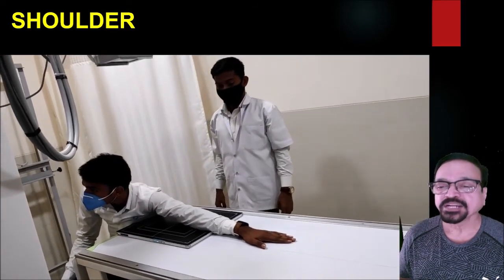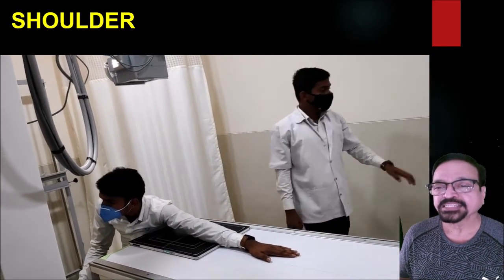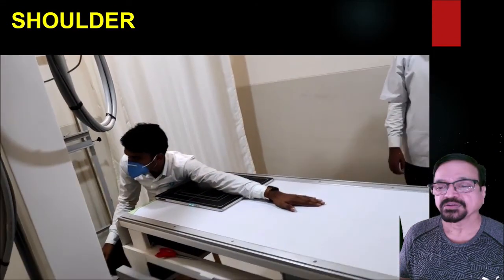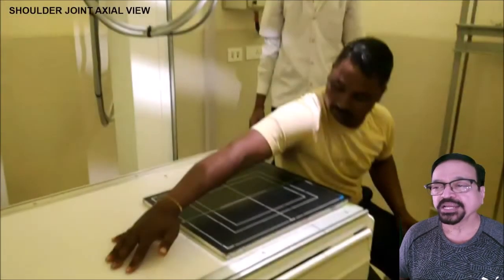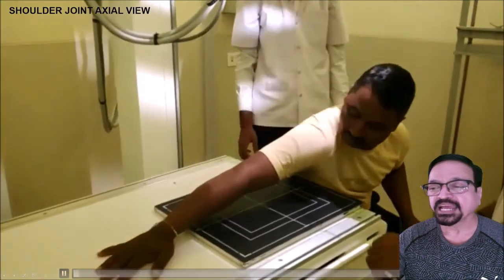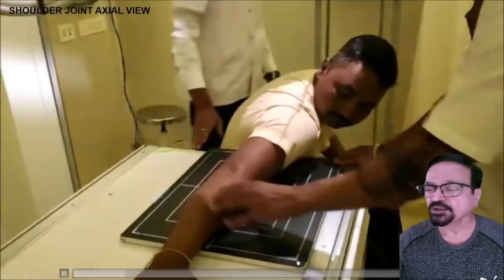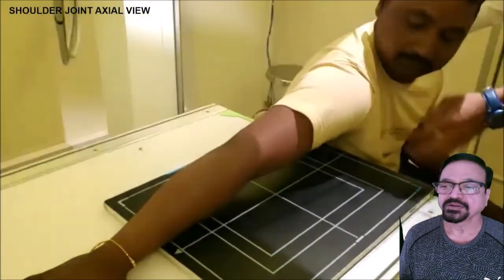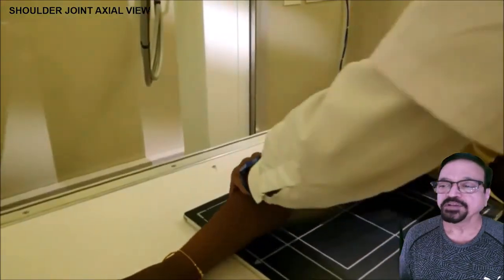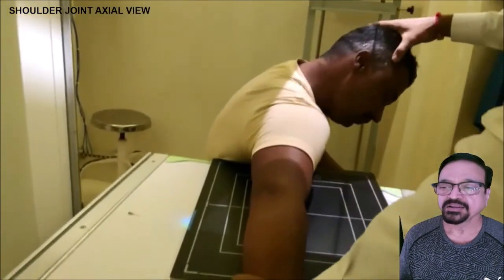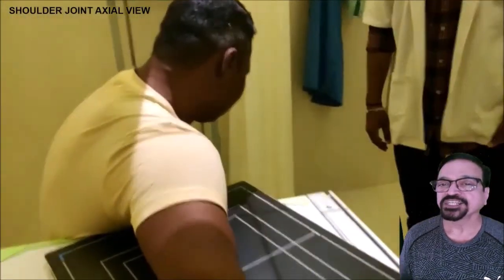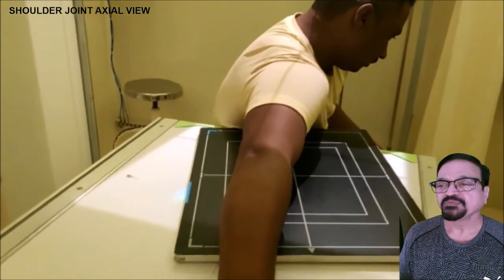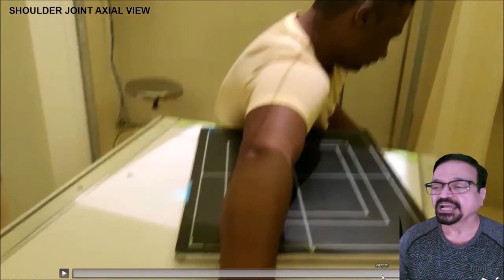Angulation may be required sometimes but not necessary all the time. In that you can get an equally good axial projection of the shoulder joint. Again we are showing with a different patient the same technique for how to take an axial. You should ask the patient whether he has a painful shoulder joint. Both videos are well describing how an axial projection is taken. Position is fine, centering is well done, and the x-ray is over.